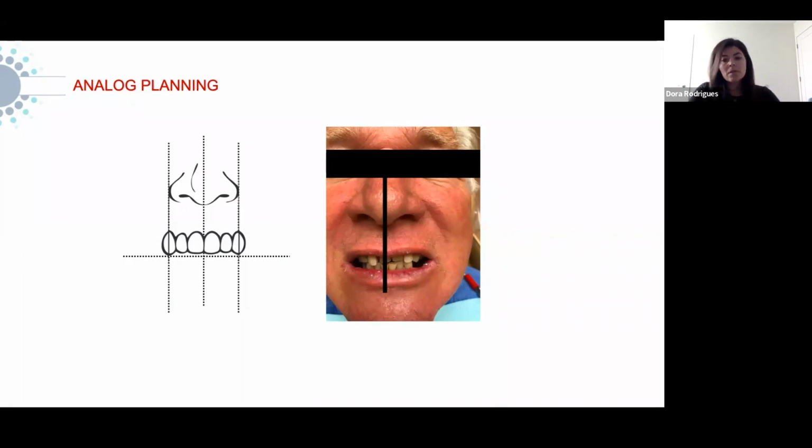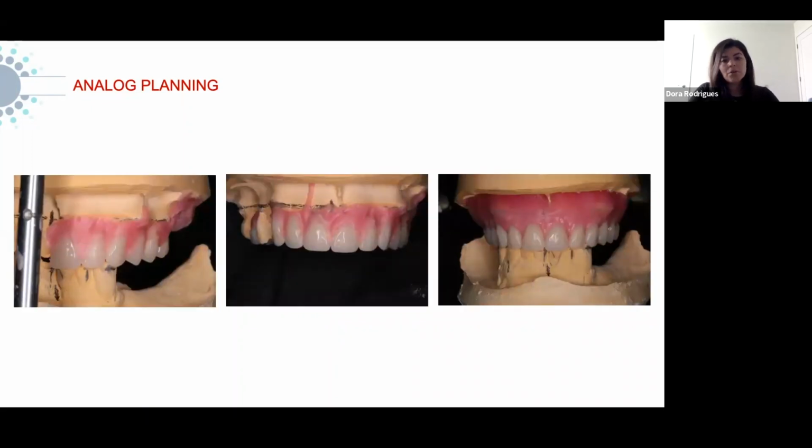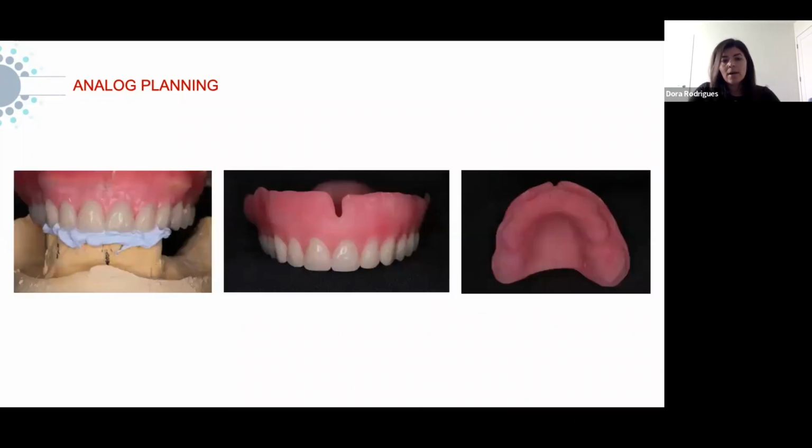And you use the basic knowledge of setting teeth. And again, consider the bone reduction for this type of cases. You have to have that space, so you have to reduce your stone cast in order to accommodate that specific thickness for your denture ahead. And then you design your case, you set your teeth, you add festooning wax, and then you process your denture.